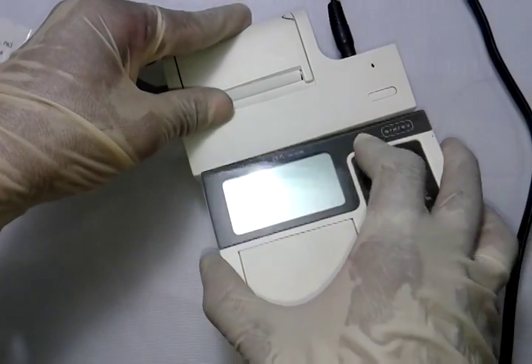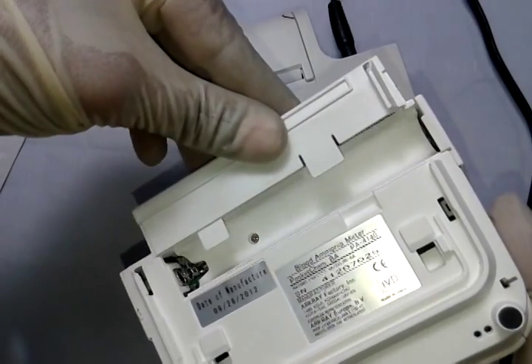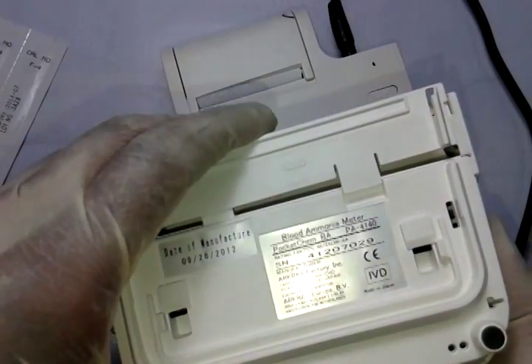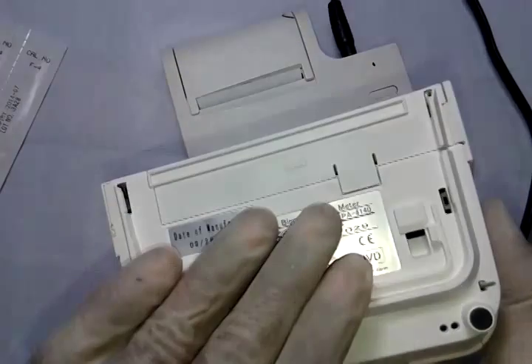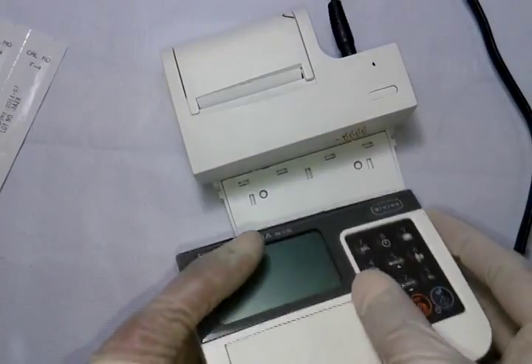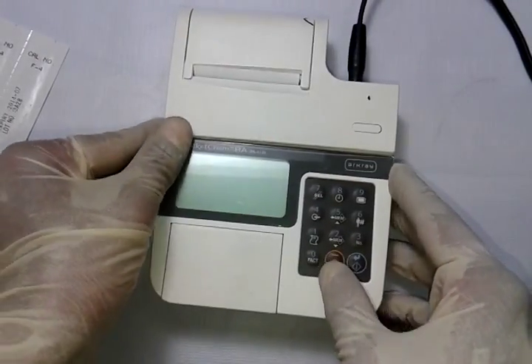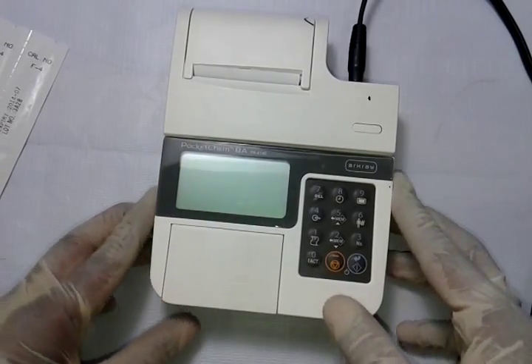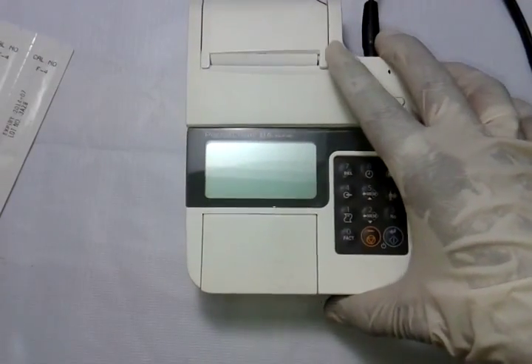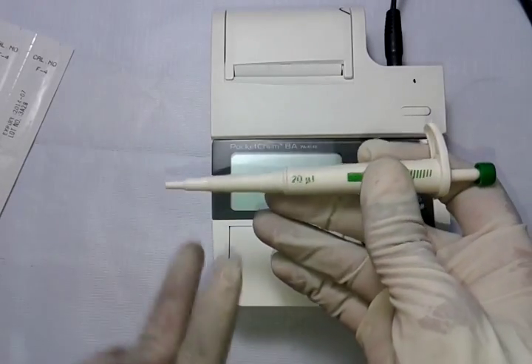The instrument can also run on two pencil batteries, so there's no need to worry about a power supply when going to the patient bedside. You can carry the device, perform the test, take the reading, come back, connect to the printer, and take a printout if needed. Otherwise the reading can be reported directly onto a hospital or lab report pad.